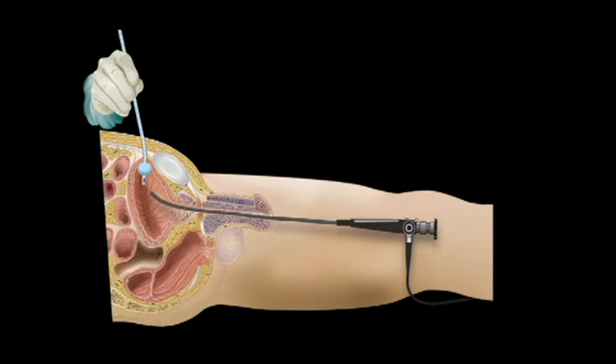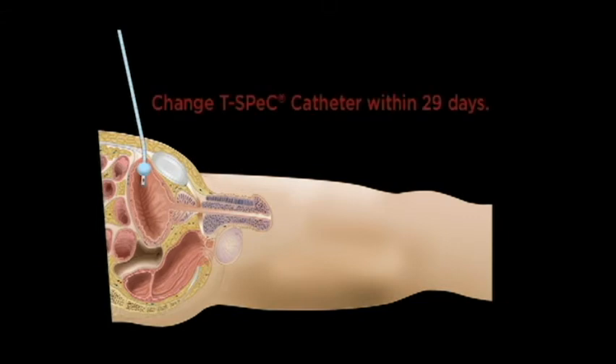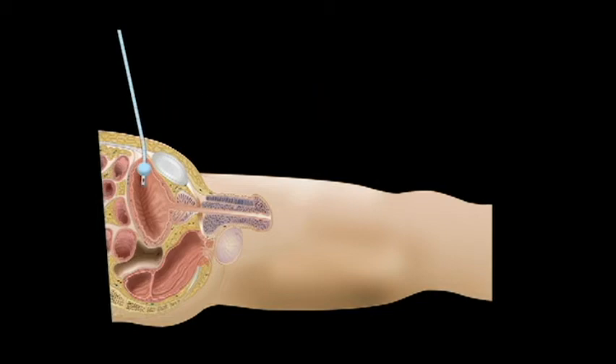Ensure the full 10 cc of fluid is transferred into the balloon and do not over-inflate. The precise nature of the surgical cut ensures correct positioning of the catheter balloon at the bladder dome. The T-Spec catheter is designed with measurement markings that correspond to the incision measurement. Cystoscopy confirms balloon deployment in the bladder. You may see some blood and discoloration in the fluid flowing from the catheter, which will quickly dissipate. It is at the physician's discretion whether to secure the suprapubic catheter to the skin with a suture. The T-Spec catheter should not remain in-dwelling for more than 29 days. For catheter replacement, particularly in large abdomen patients, the open-end T-Spec catheter will accommodate a guide wire to facilitate future suprapubic tube changes. The T-Spec 18-French suprapubic catheter is now properly positioned and ready for use.